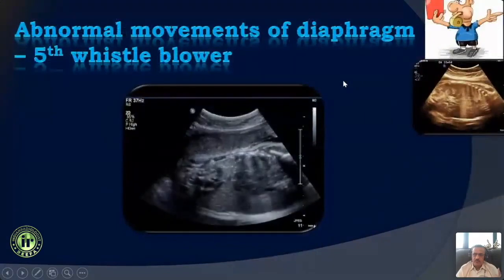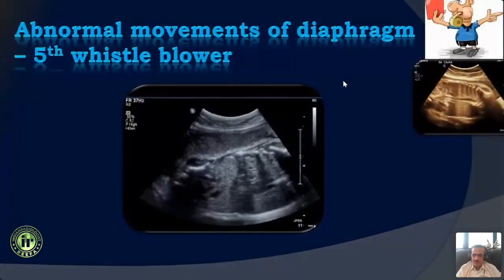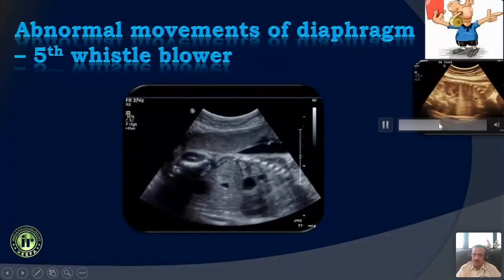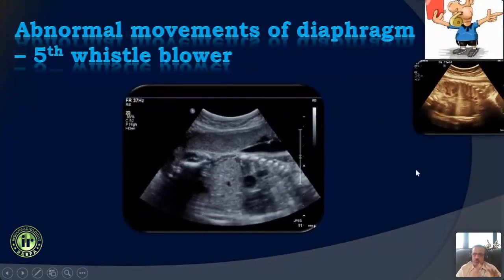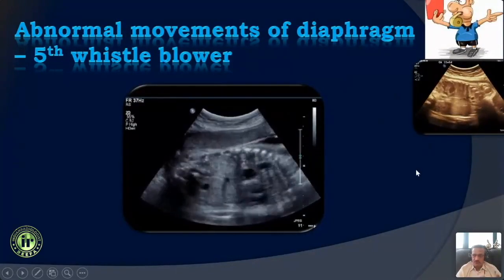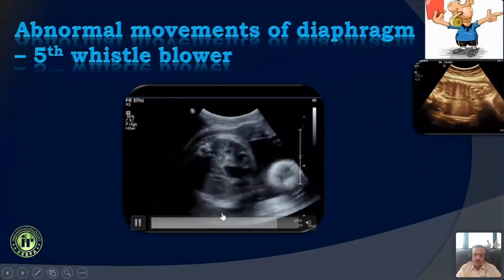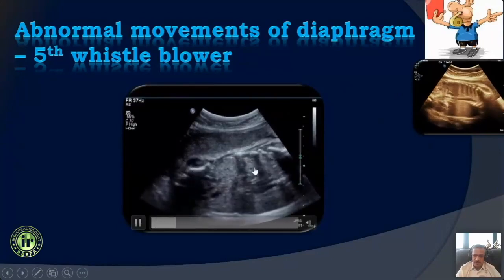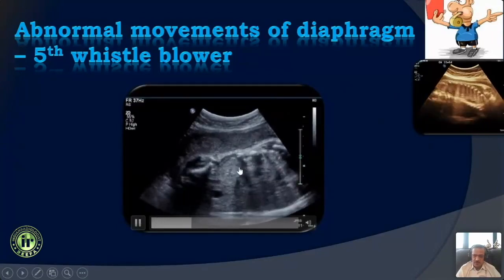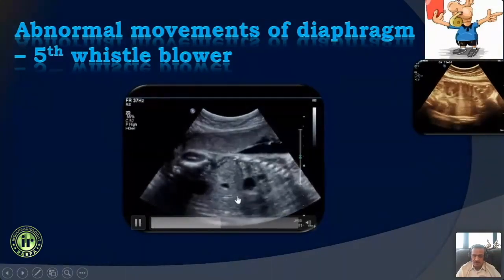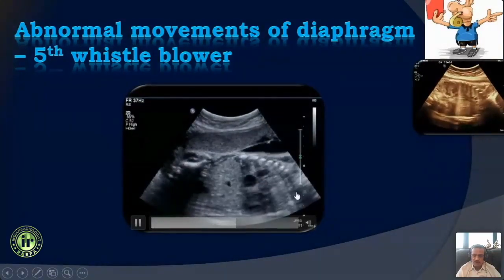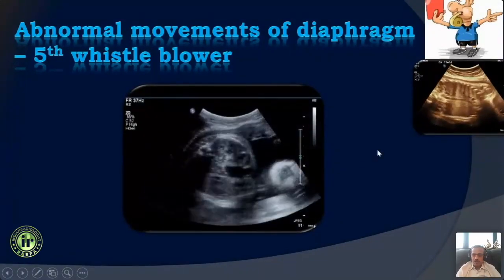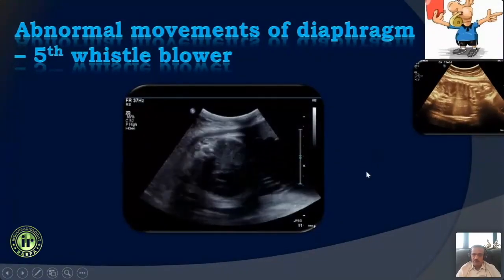The fifth whistleblower is the movement of the diaphragm. Both leaves of the diaphragm should move synchronously — that is very important. If you see paradoxical movements of the diaphragm, as shown here, where one leaflet is going up while the other is going down, that is another whistleblower for a possible thoracic abnormality.